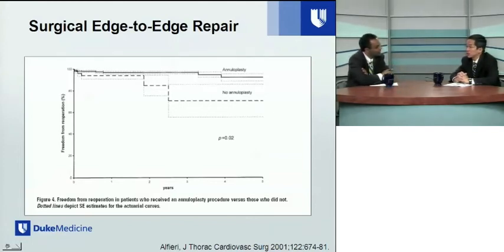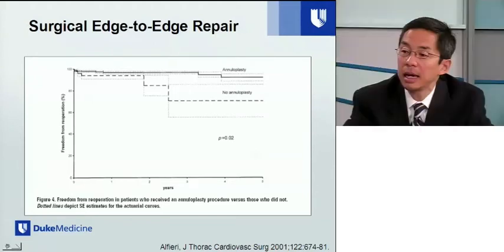Yeah, that's a very important question as we consider a trade-off between efficacy and safety. The results of the patients who had unsuccessful clip repair showed that all patients had their intended mitral valve surgery subsequently. There were several patients in whom repair was not deemed feasible at the beginning of enrollment, and those patients who had failed clip went on to mitral valve replacement. But the majority were able to have repair techniques. They are actually developing a device to aid in removal of the clip so that it becomes less traumatic to remove, especially if there's already ingrowth of the clip to the leaflets.